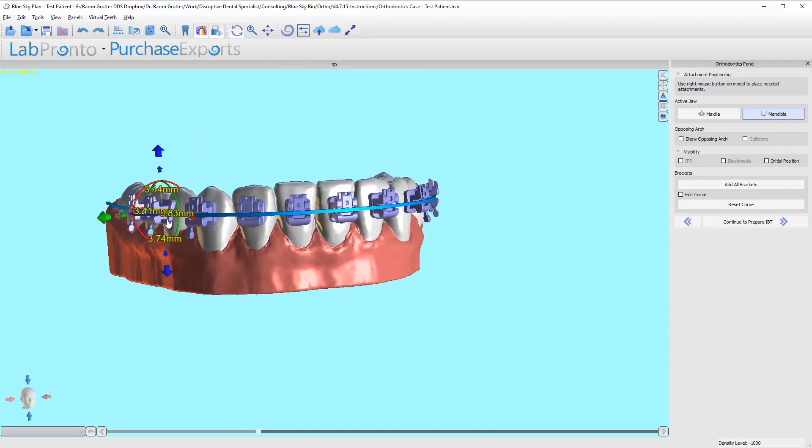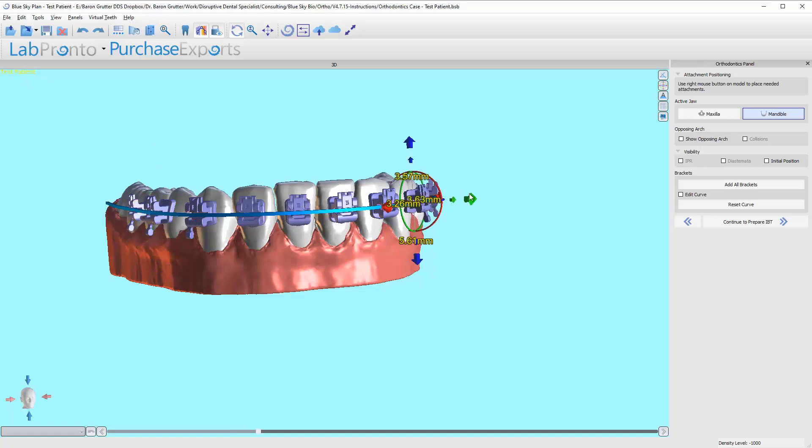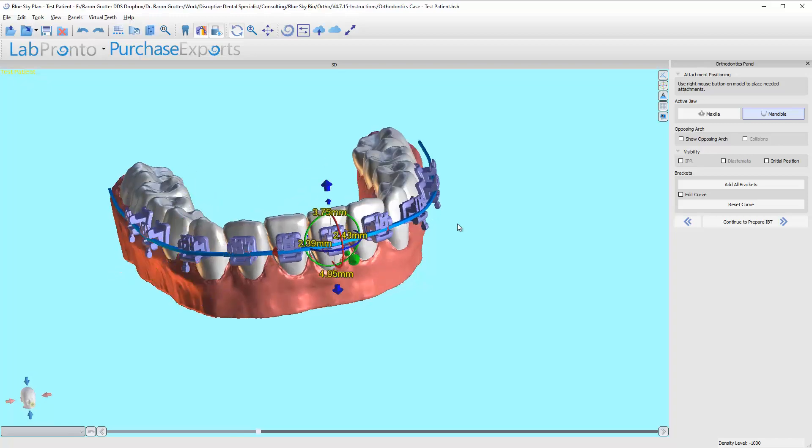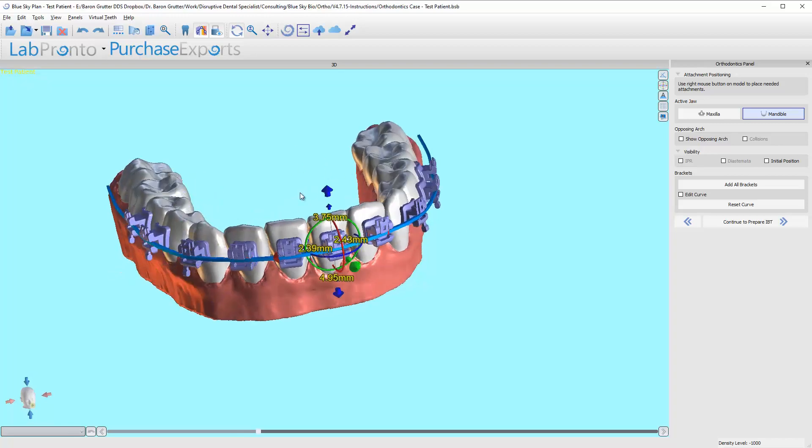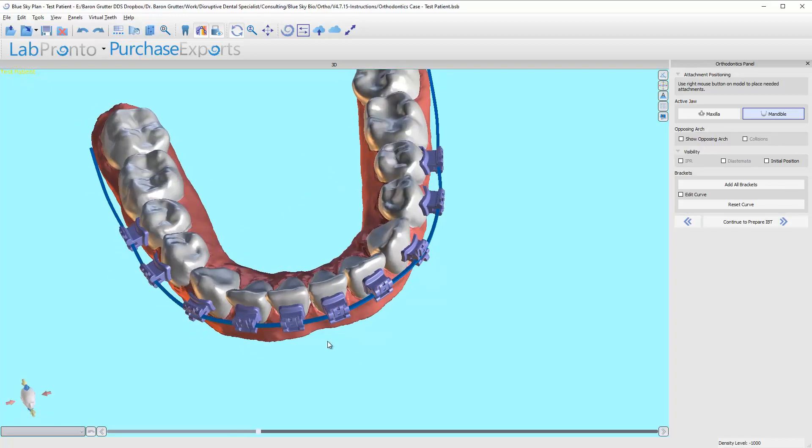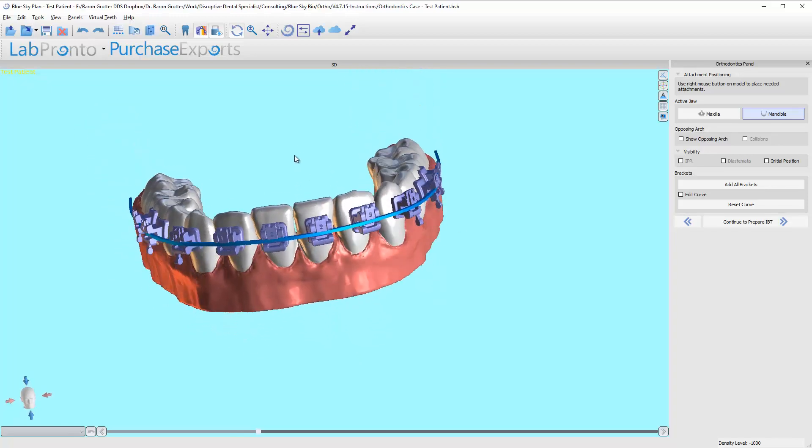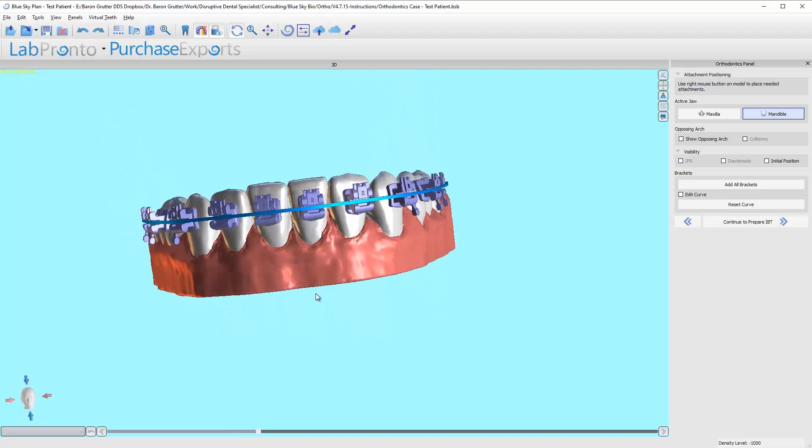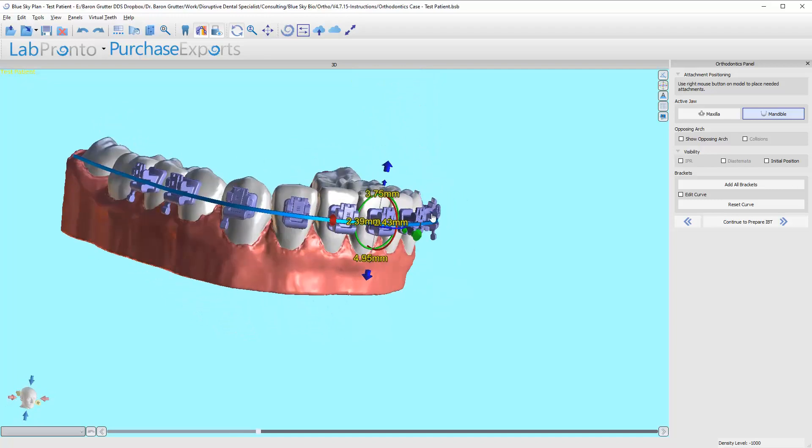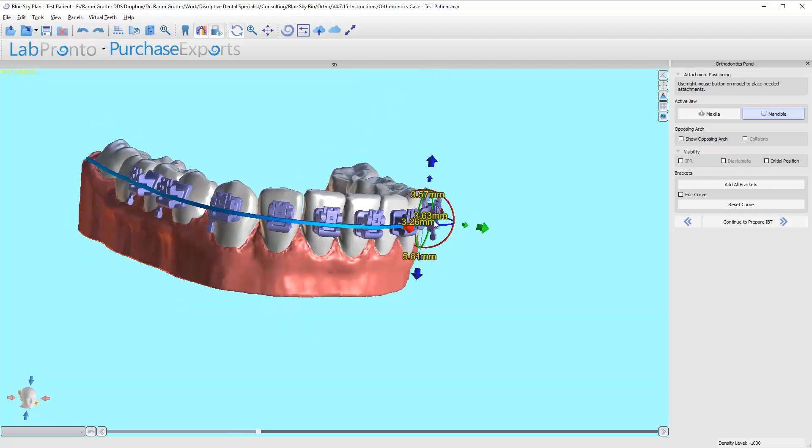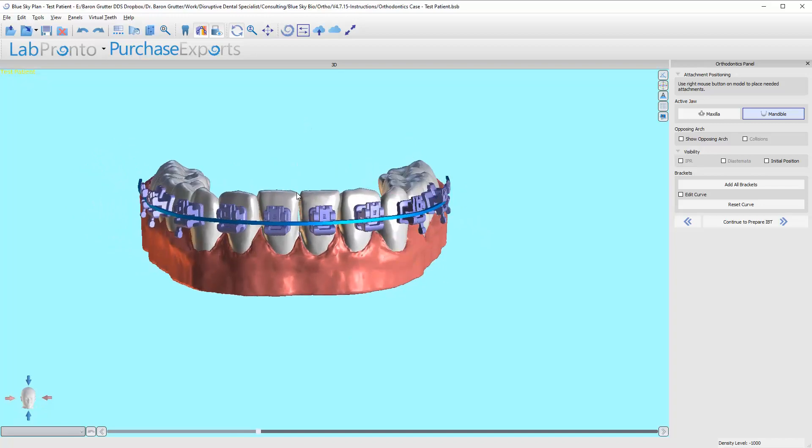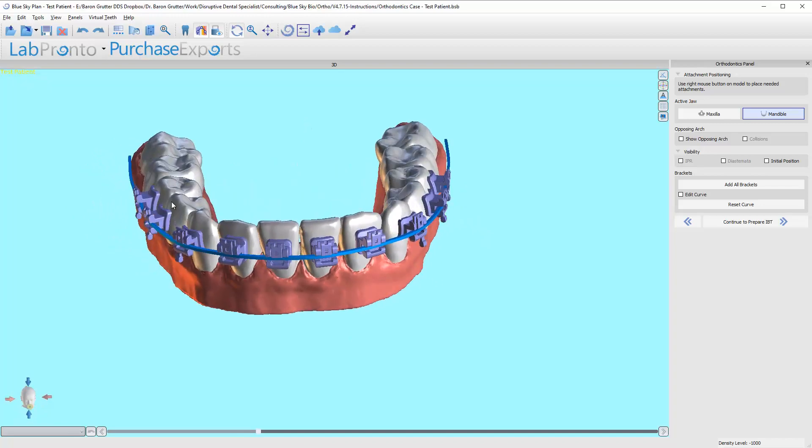The whole point is you've aligned the teeth how you want them. These brackets are now straight on a wire, a rectangular wire, and now the teeth will end up in this final position. So anyway, that's the purpose, that's why it's doing that. It is fully intentional. But you're going to end up with thicker cement on various areas because your goal is to have your teeth line up exactly in this manner.